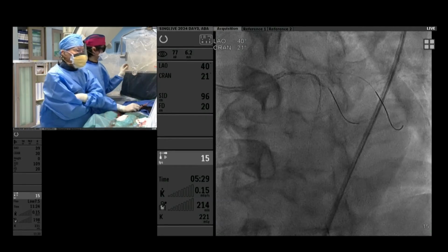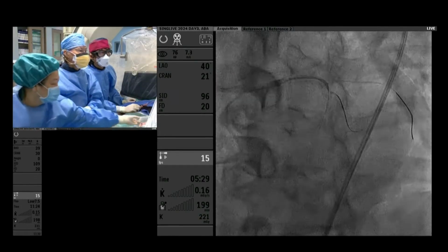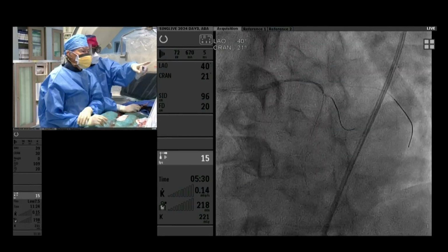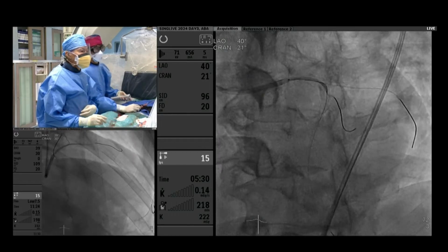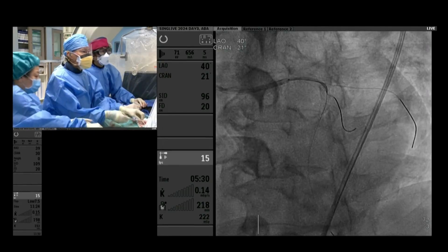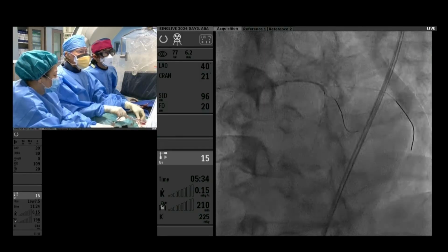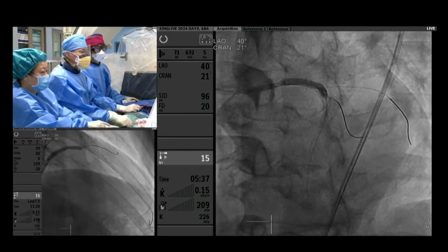Or on the other hand, because you're using IVUS, you already have a marking in the proximal LAD. So you are not judging from the proximal, but try to use the exact length, because nowadays you have so many kinds of stent with various lengths, starting from 15, 16, 18 to 20, or even a little bit longer. So it depends on how much to overlap, and then on your IVUS length, and then try to choose the right size. Then you should just focus on the overlapping region, and it should be okay.